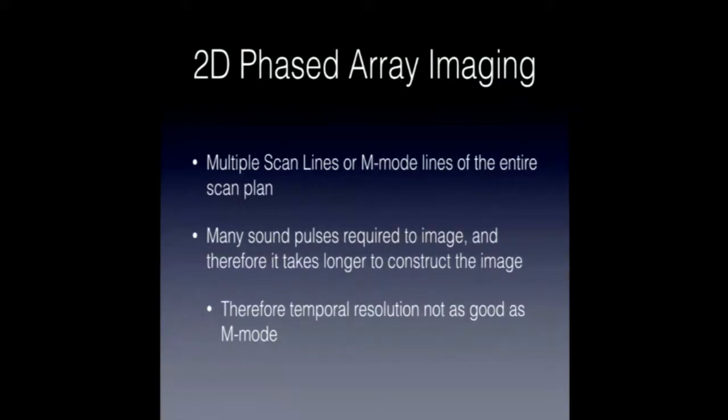I've used it for tamponade. If you're wondering about some wall that's wiggling and you're wondering if there's diastolic collapse, then you could put M-mode on that wall and then break it down and see. It probably should be more of a clinical diagnosis than what I was doing, but it is interesting.